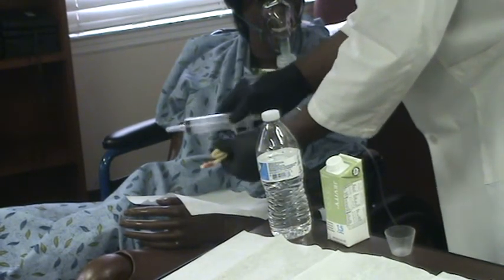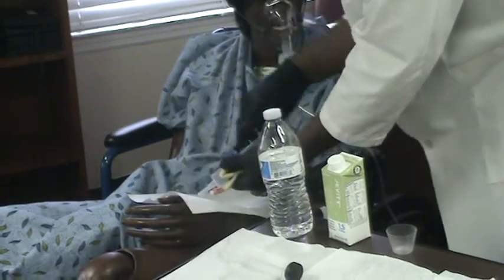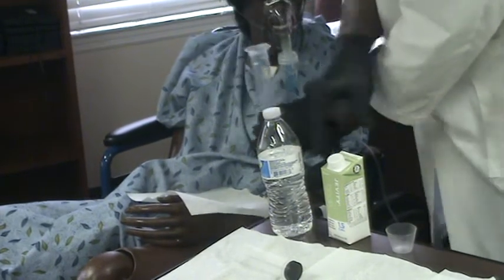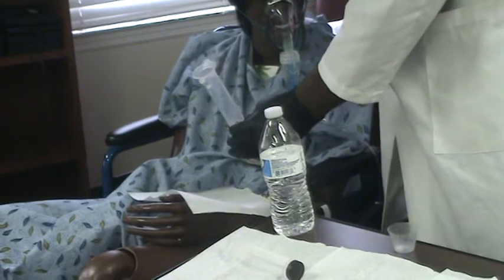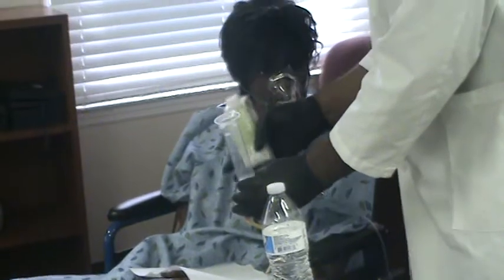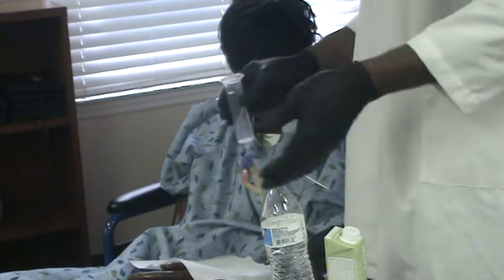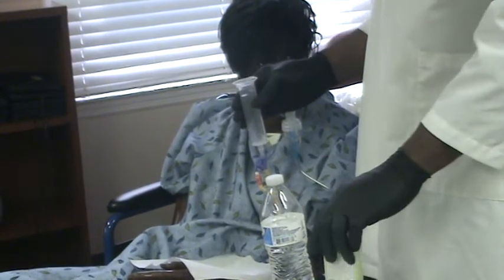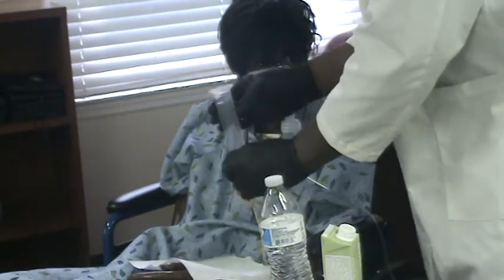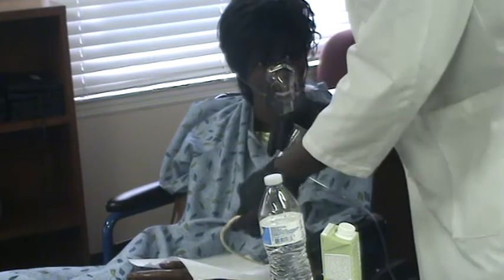Close it, remove this, and insert this back. Now you're ready to do your feeding. So this is half feeding. Open it up and just pour in there, until you've poured all of it. When you finish the feeding, you flush again with water, like half a cup. You pour and flush, then the tube is open and clean. Then you're done with that feeding.